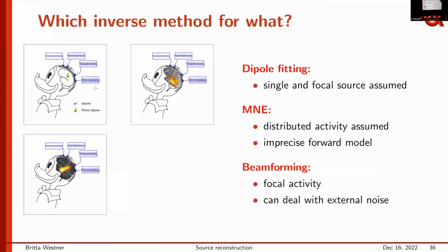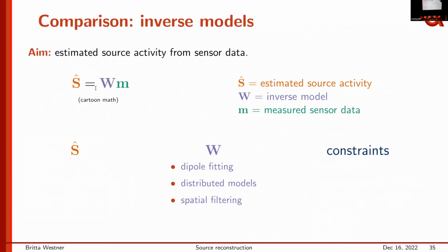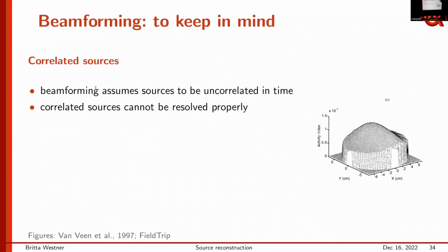Yes, so maybe we can actually see that here. It's true that, of course, neighboring sources are correlated with each other by definition, but also because they are correlated with each other by definition, it's not bad if it locally looks like this, right? It reflects what really happened.